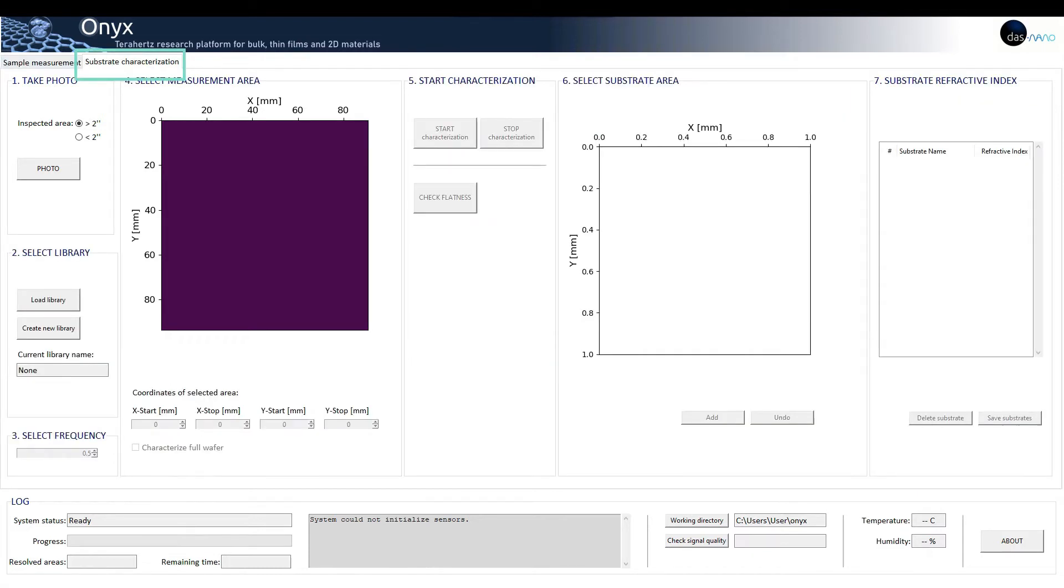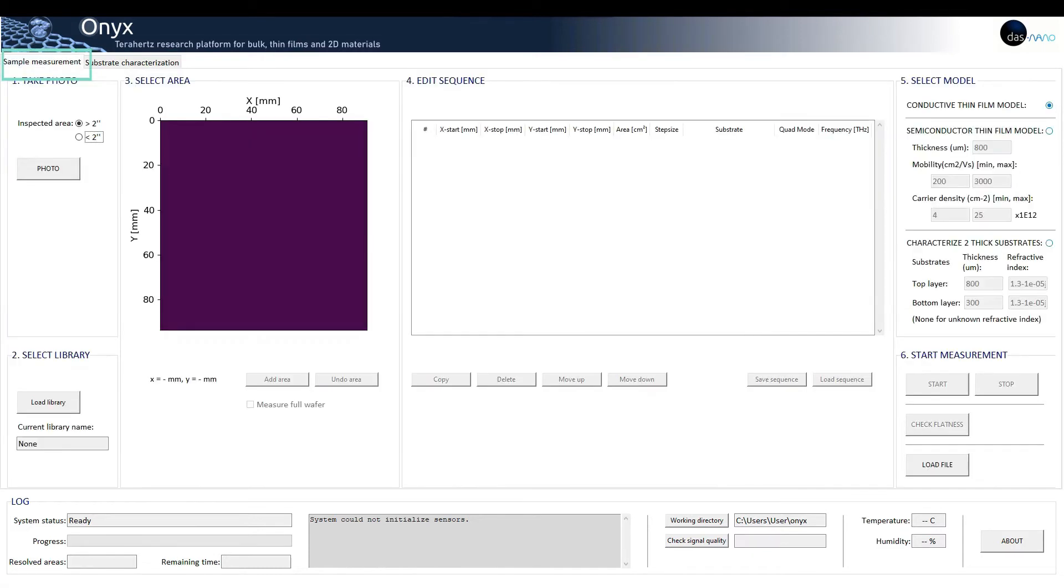Substrate characterization and sample measurement tabs. Once we perform a substrate characterization or a sample measurement, a third tab will appear called sample results tab.